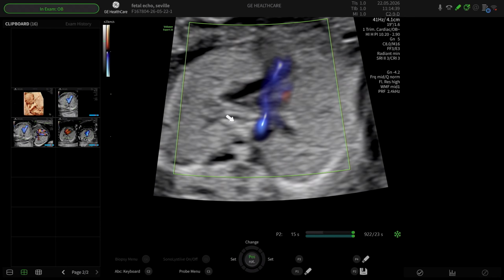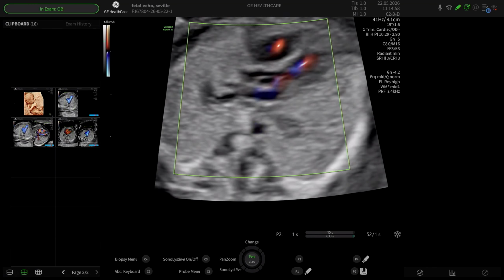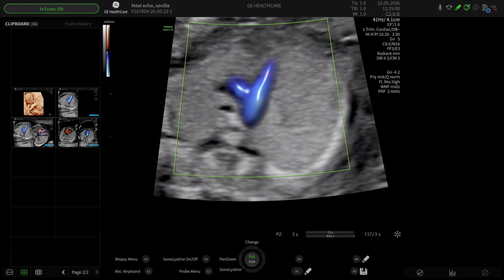And you can see the cartilage of the bronchus on this side and on this side here. There is another nice control in any of these, which is speckle reduction and compound imaging for seeing these tiny little vessels, which you can use.